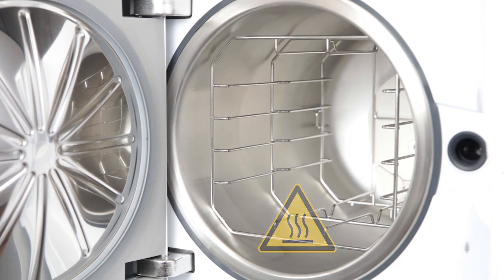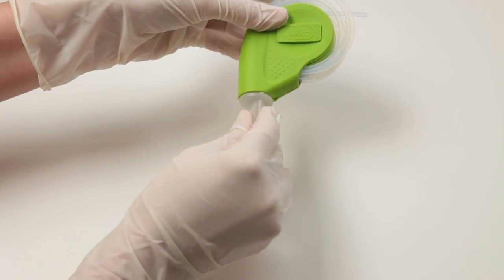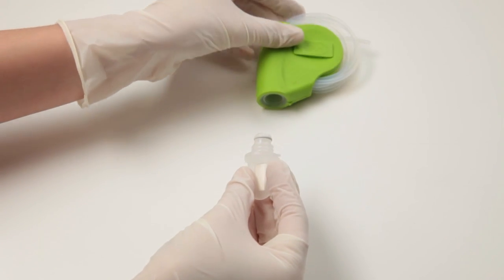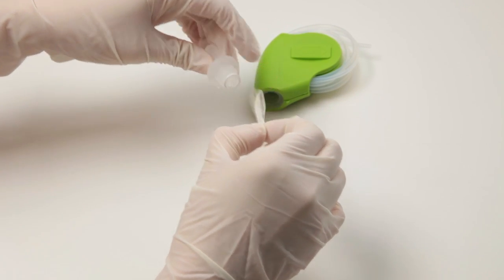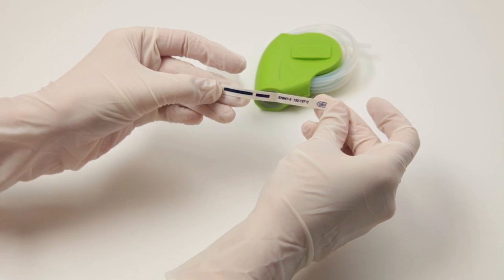When removing it, be aware that the test device is very hot. Allow the test device to cool. The indicator test strip can now be removed from the test device. In the event of a positive test result, the indicator strip will have changed colour completely and there will be no colour variation.